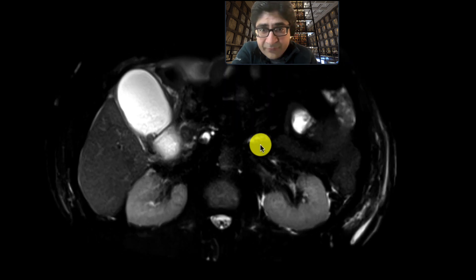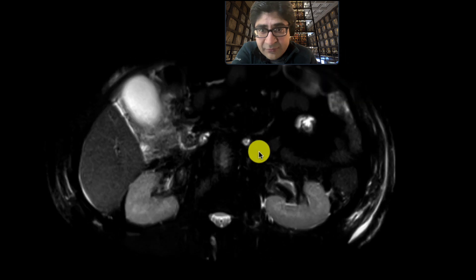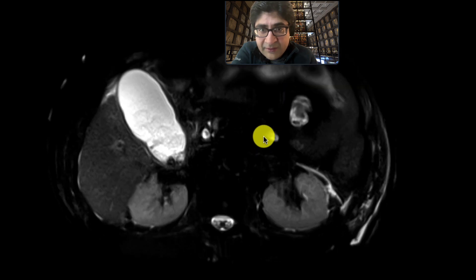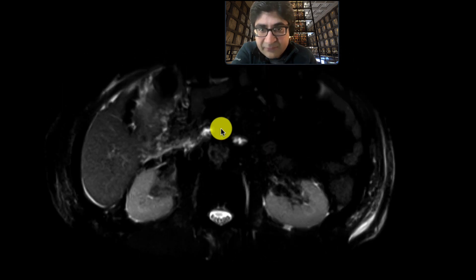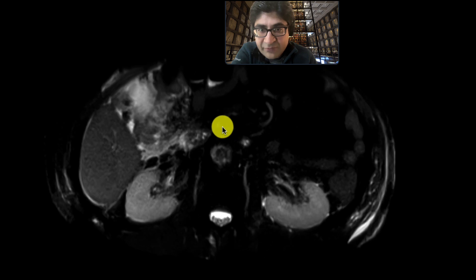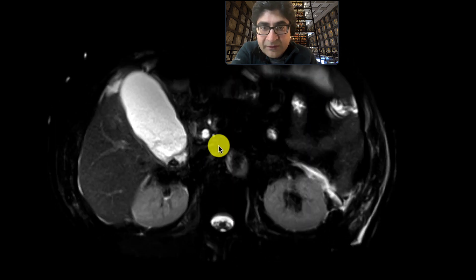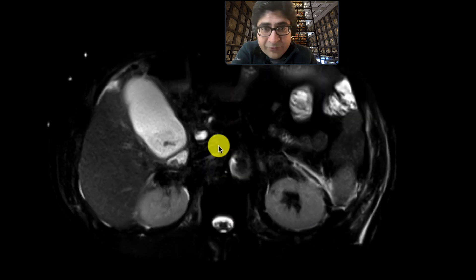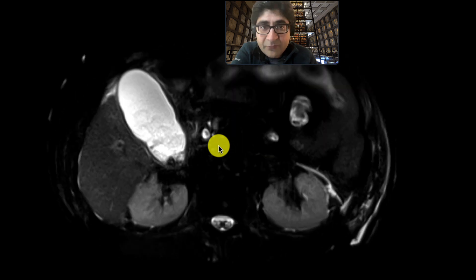So we have a distended gallbladder with fill-in defects. We can see that the wall is a little bit thickened, and there's pericholecystic fluid and inflammatory change surrounding it. All these findings are consistent with acute cholecystitis.